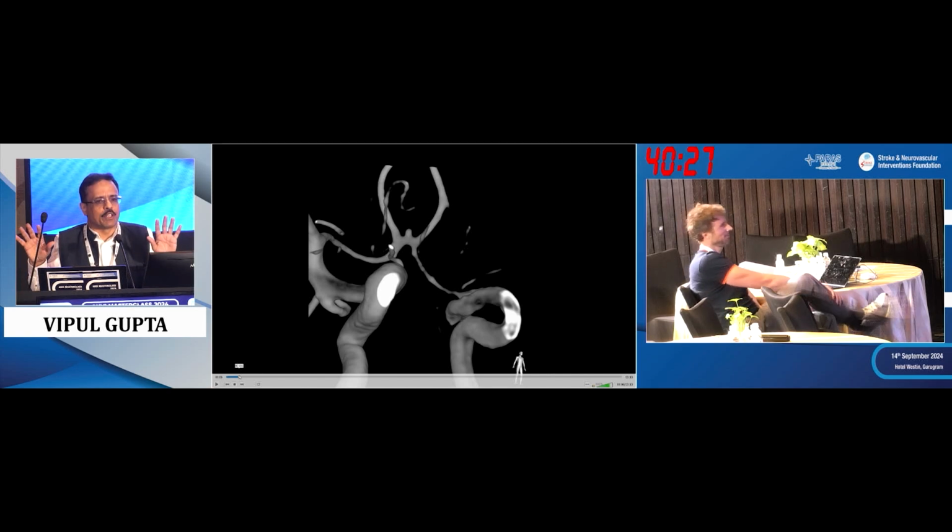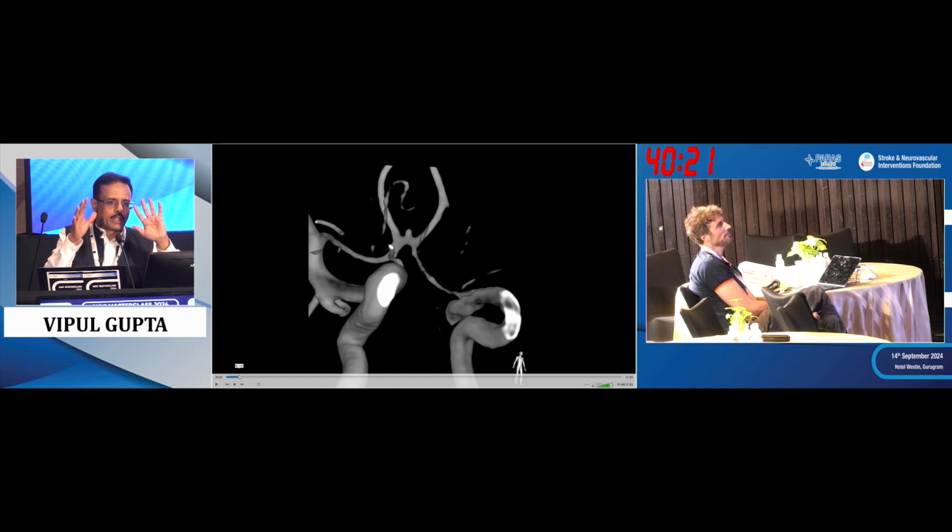So each step you take your time. You place the microcatheter there, withdraw, you take a run. Is it pointing there, not pointing there? Is it all right? Do we need to shape the micro? So I kept the microcatheter a bit shaped. Sometimes we give it a reverse shape to make it point there. Partially deployed stent, and take your time and deploy the coil over a few minutes. It's not just pushing it in, so that you're very sure about the feel of the coil, the way it's going. Okay.